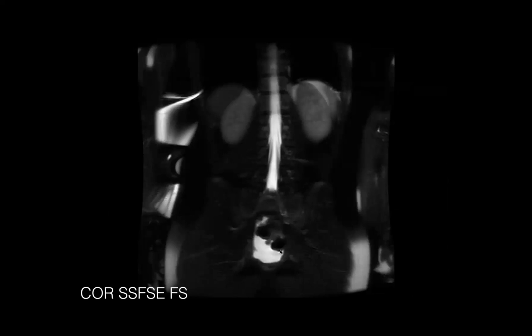So do you typically do MR for appendicitis? Isn't it an acute case where they're rushed in? No, the first step is ultrasound. If ultrasound can establish the diagnosis, then done. If it can't and there's still a suspicion, then we get an MR. We used to do CT, but we've stopped that for the most part because of radiation concerns, and do MR. In MR, it's really these single shots that go a long way.